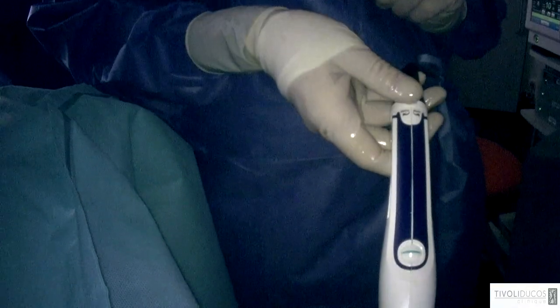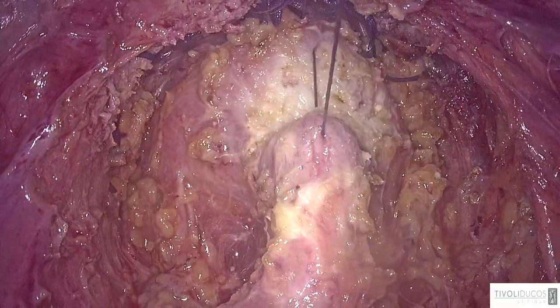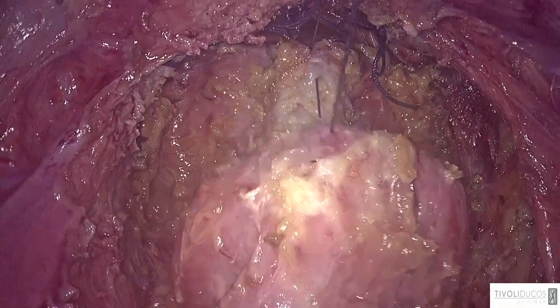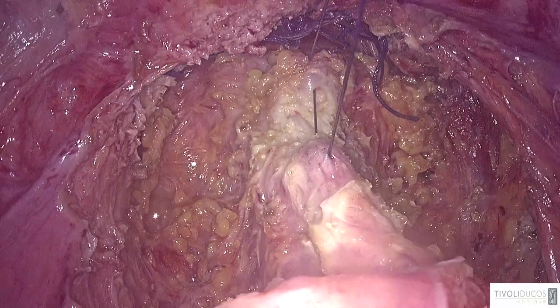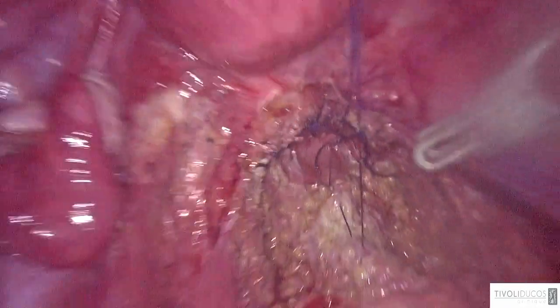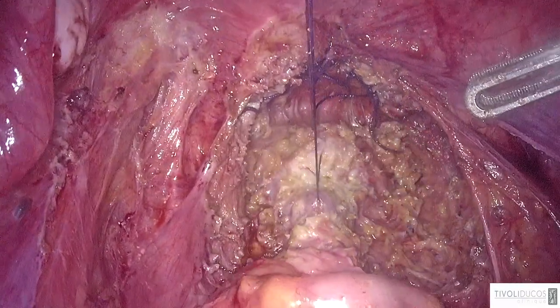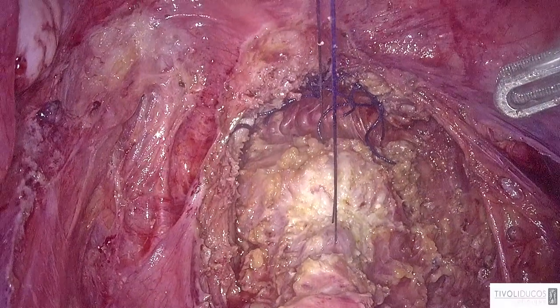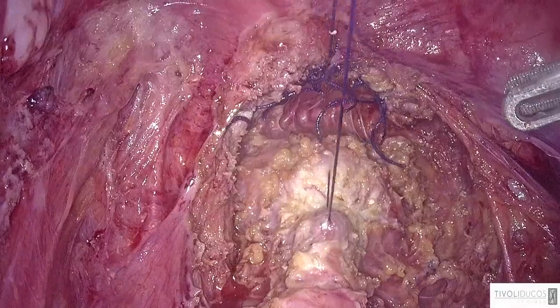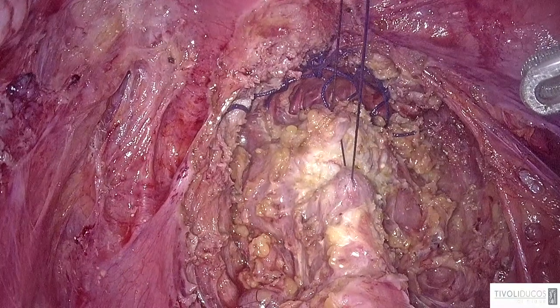So now, he put the stapler into the rectum, and now he will completely close it. The stapler is below the nodule. And now he will open. Okay, and you see how the shaved area is placed into the anvil and the shoulder. And now that is a moment for me to go to the next step, which is the knot. So I will carry out the knot. I use an extracorporeal technique.